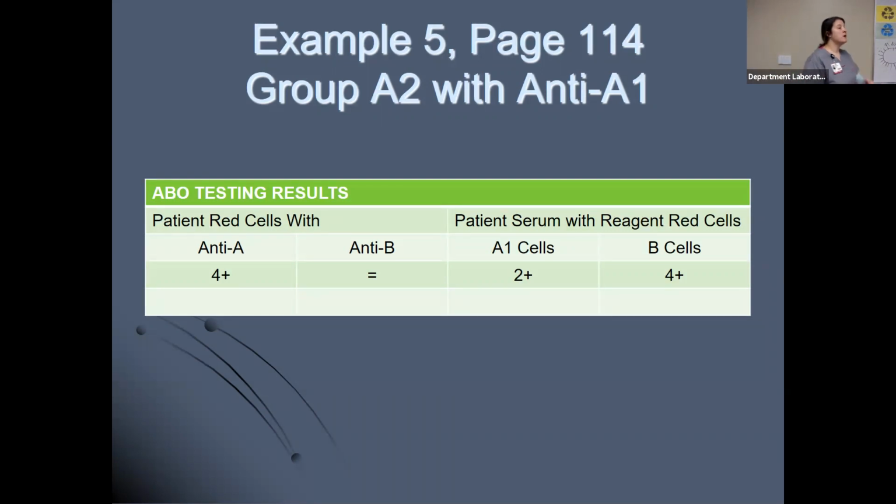So the most common discrepancies you'll see in blood bank, you'll see subgroups of A. It'll give you this reaction. You'll have this quite a bit. You'll run A1 lectin and A2 cells. You'll identify your patient as a subgroup of A. Anti-M is notorious for reacting at room temperature. It will interfere with your back type. I saw that a lot in blood bank. And so you'll have that.